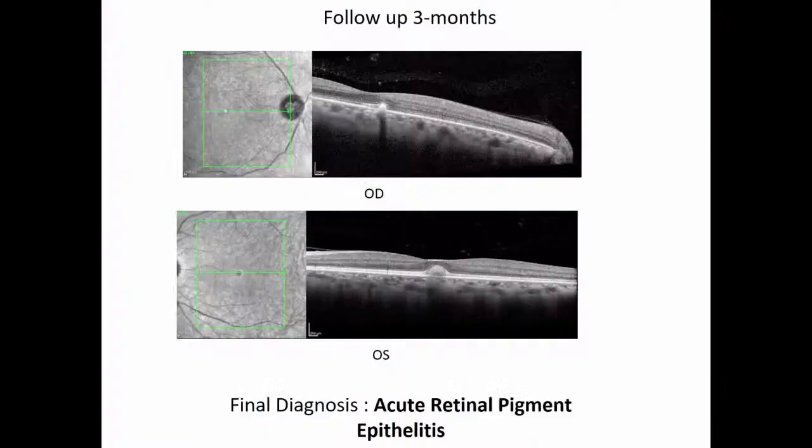We did OCT scans at 3 to 6 months. There has been no change in the lesion. So OCT here was helpful in not subjecting her to IV steroids and the whole consequences of events that would probably lead to misdiagnosis.